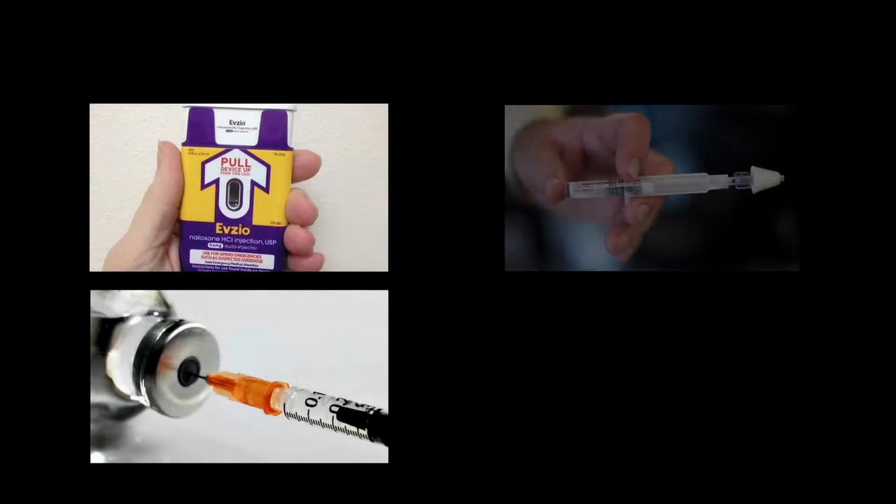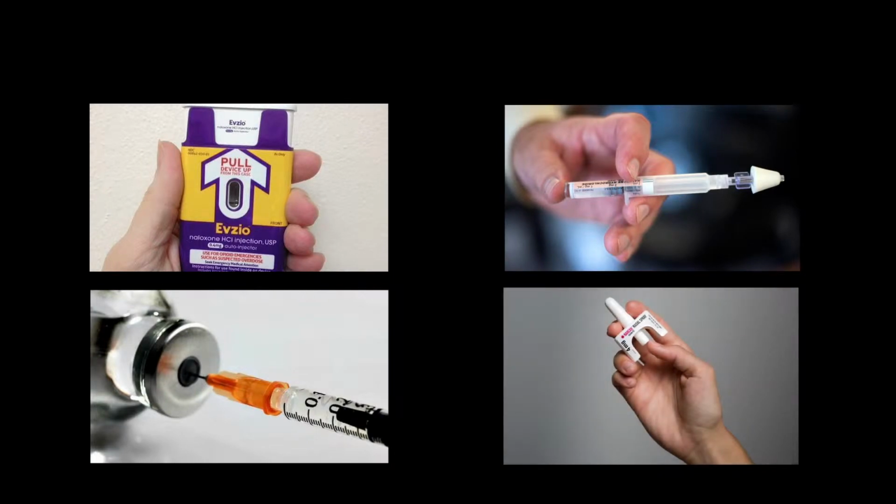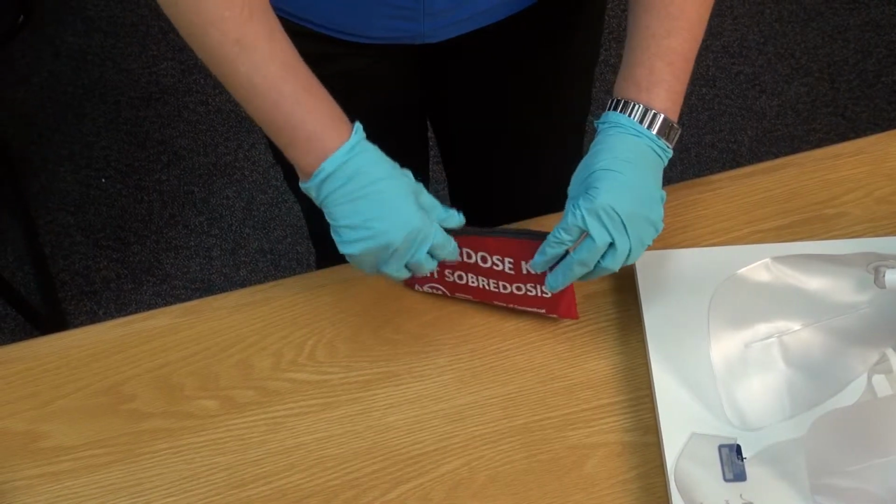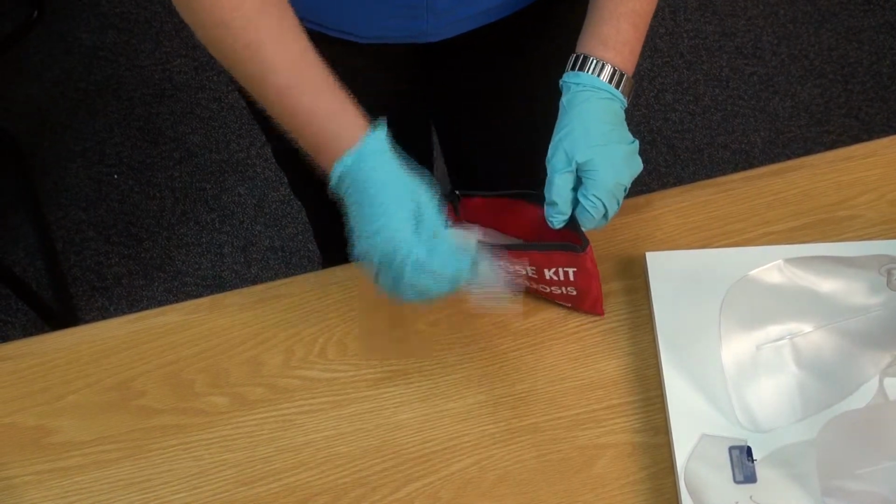Currently, there are 4 formulations of naloxone used in the community. 2 are intramuscular injections, and 2 are intranasal sprays. The first intramuscular injection is the traditional syringe and medication.